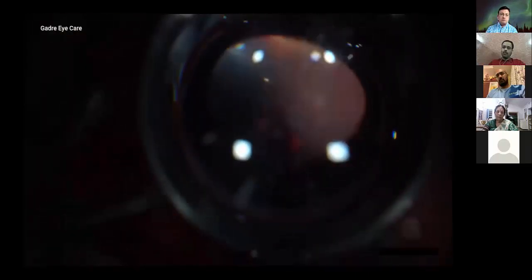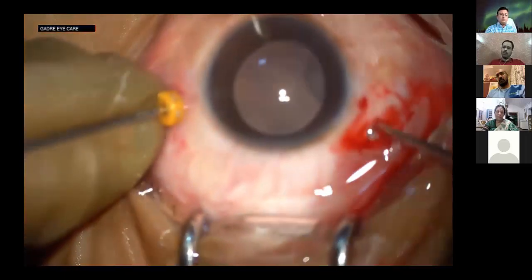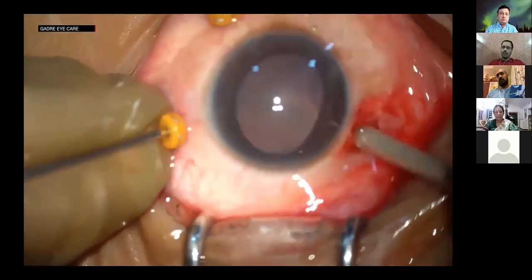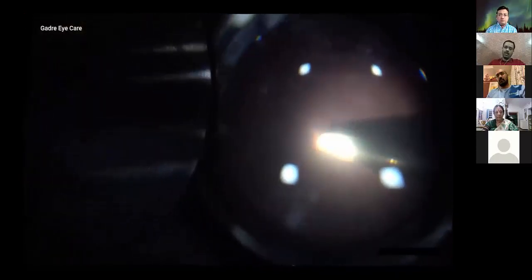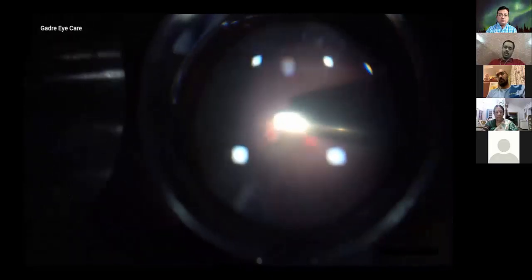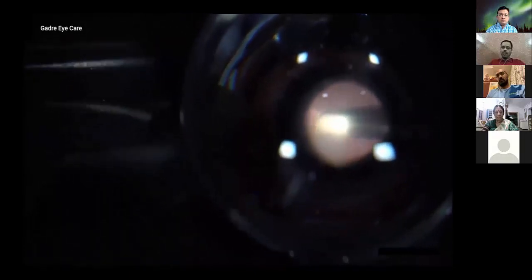This is just the small snippet showing the 360-degree depression, which is a must to rule out peripheral lesions and to locate the foreign body. Not seeing any other foreign body, what I decided was to insert a big 18-19 gauge magnet that we have, and I considered it to be subretinal, hoping that with the pull of the magnet it might pop out from the point of entry, whichever it might be.